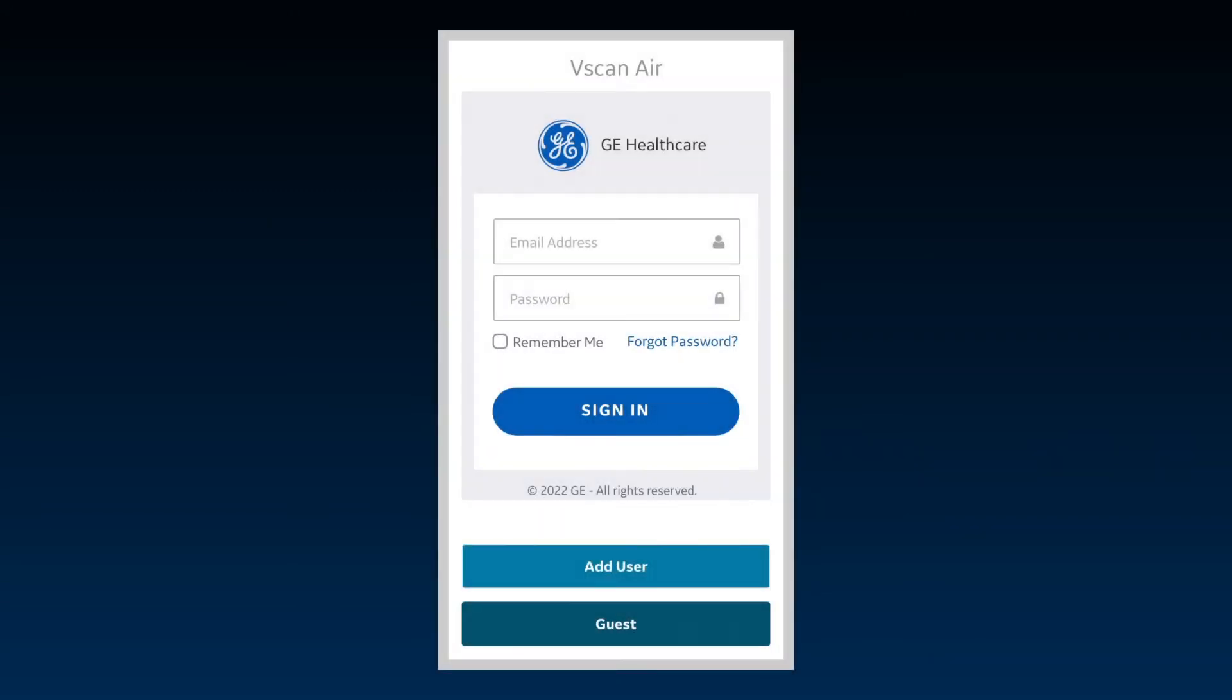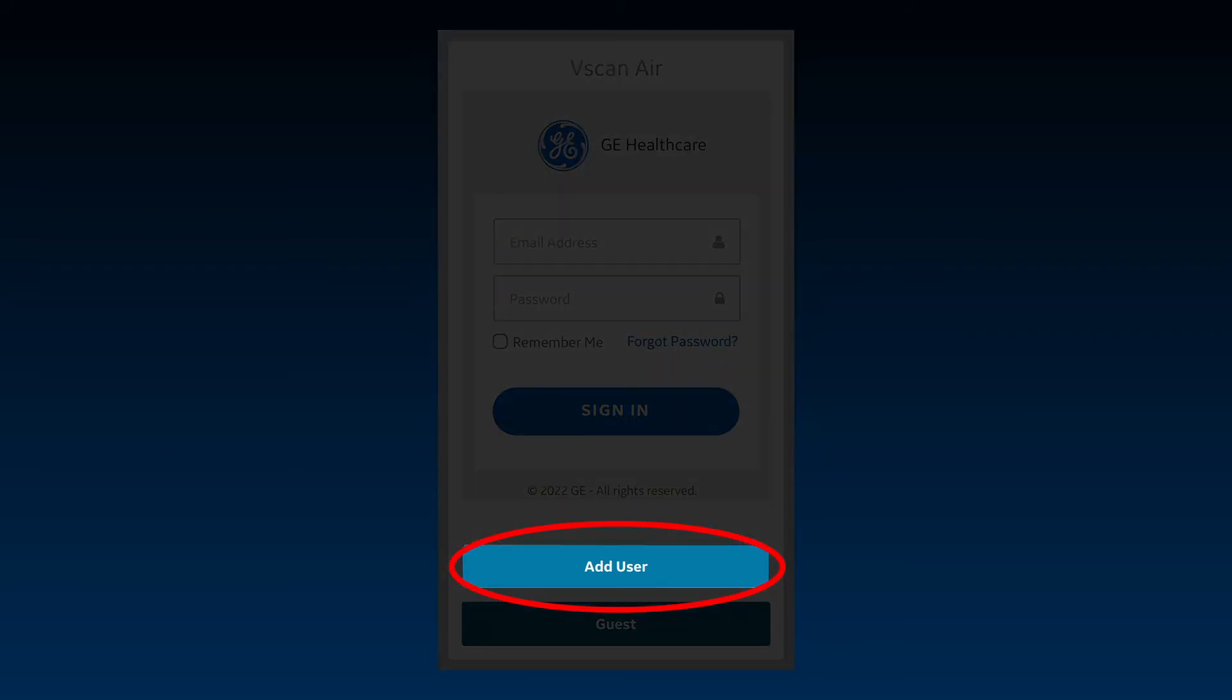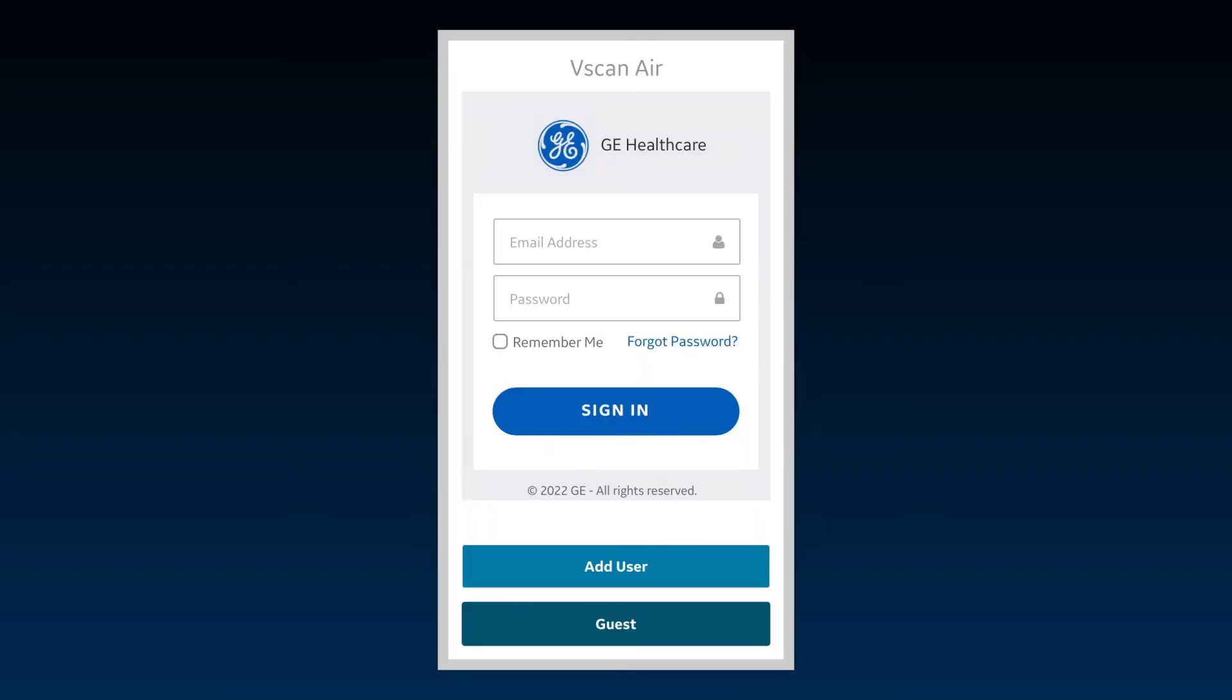Each user using the vScan Air app on a shared mobile device can sign in using his or her own account credentials. If you don't already have an account, you can create your own account by clicking the Add User button at the bottom of the screen. Note, the Add User button will only be visible after an app has been registered on a particular mobile device.